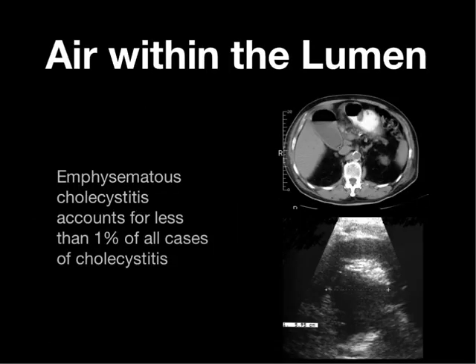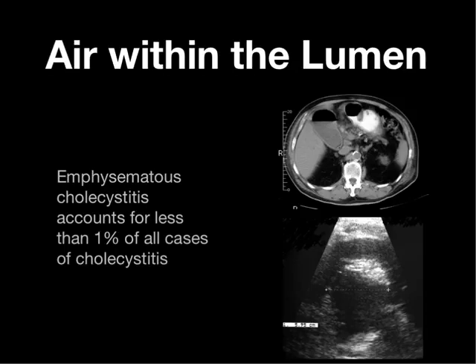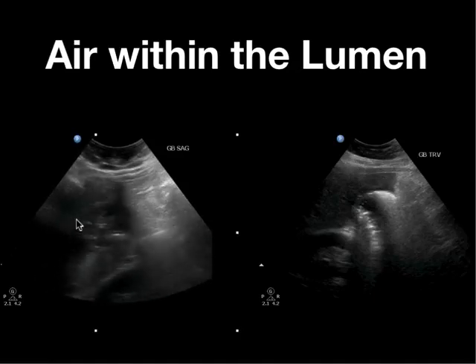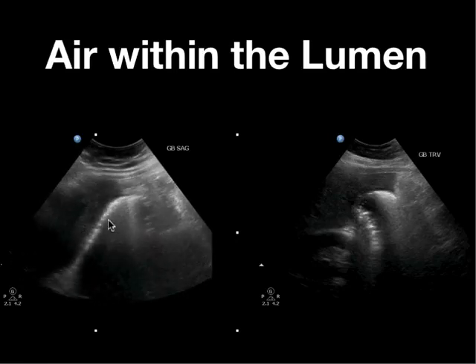What about air within the lumen? Air in the wrong place is never good. Emphysematous cholecystitis accounts for less than 1% of all cases, but these are usually more advanced cases and these patients can be sicker. On CT you can see a large amount of air anteriorly within the gallbladder. On ultrasound you can see multiple echogenic areas with posterior reverberations, all consistent with the presence of air. The intern scanning was having a hard time identifying the gallbladder and assumed the dirty shadowing and reverberations in that area were just bowel gas.